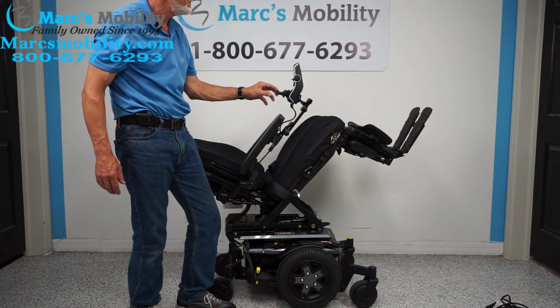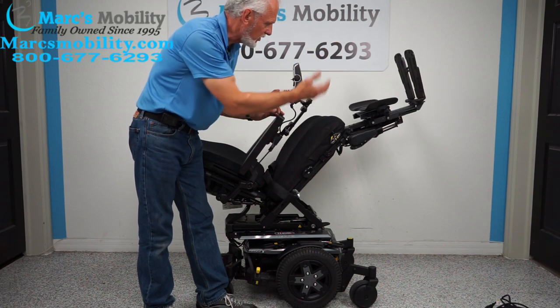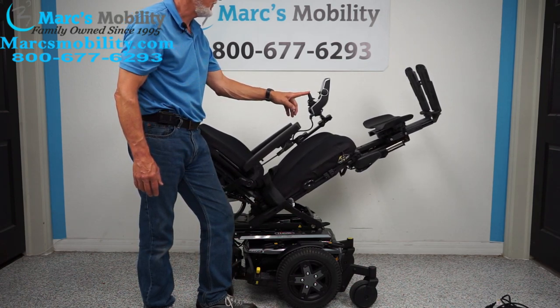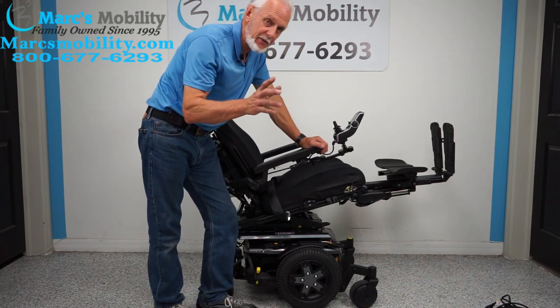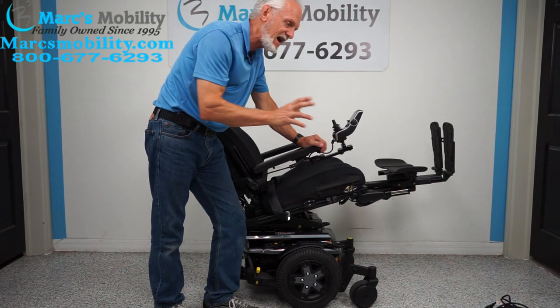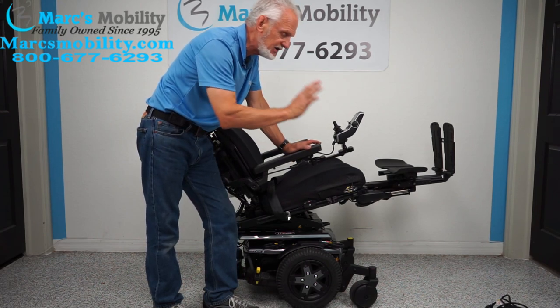Next are the electric feet. I'll show you how high they will go — this is extreme elevation for maximum circulation. You probably don't need to be quite that high. Also, if you ever have one of these chairs and you see a red X in a circle on the screen, that means your seat is too tilted or too reclined. You need to bring the tilt and seat down until it turns green, and then you can drive again.